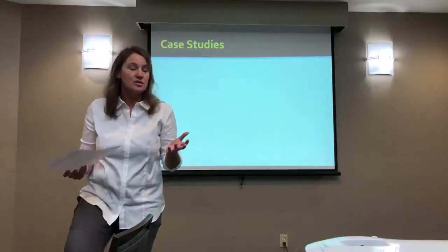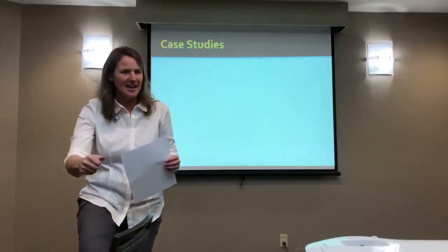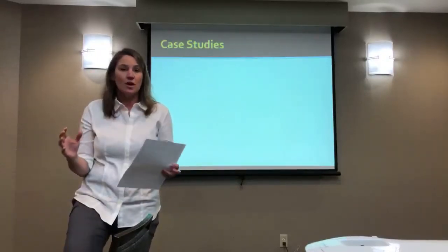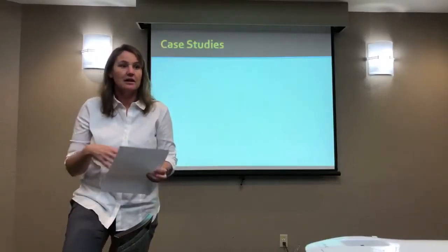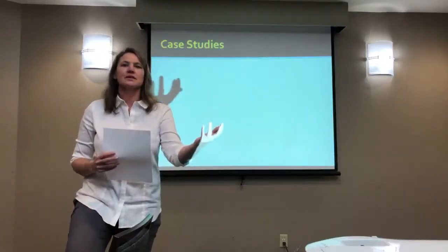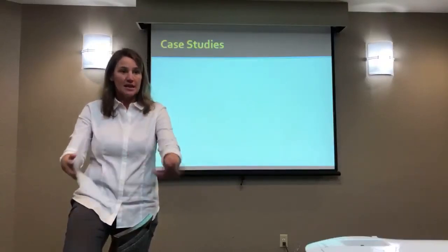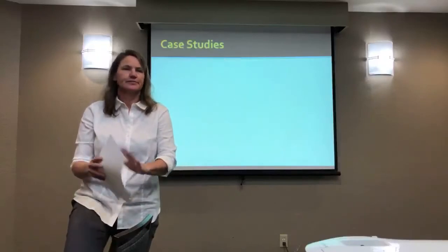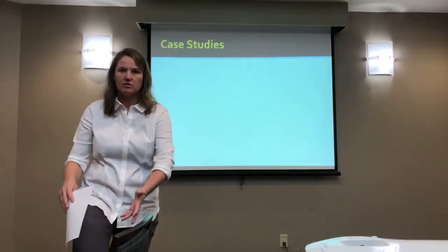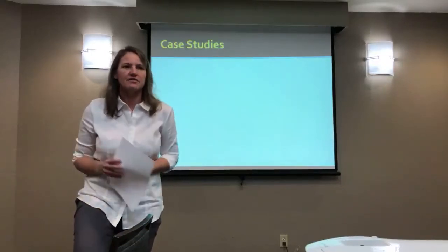Now, on the other hand, if this was someone who treated elite athletes, and they're like, I've got to be back in the game by Friday, and I'm like, I don't know if this is really going to help, but I see no reason why I couldn't try it, and it's not going to harm you in any way. Well, let's do it. We're going to do it because there's no probability of harm, and there's a possibility it could be of benefit. But if it's someone where I just want their body to do its job, and their body is likely going to heal, I don't see any reason why they're going to have any kind of negative outcome. I don't need it. I can look at them and make sure that they aren't causing any more harm and help them return to normal and weight bearing and all that kind of stuff as time goes by.